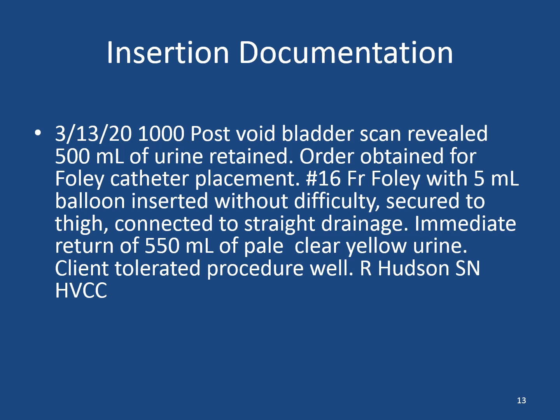So the big things that you're noticing from this note, number 1, we have the reason why the client is becoming catheterized. This is one of the essentials of charting. We've got our date and time. We've got our catheter size in there, which is on the package for the catheter. So it's going to be right on the package.